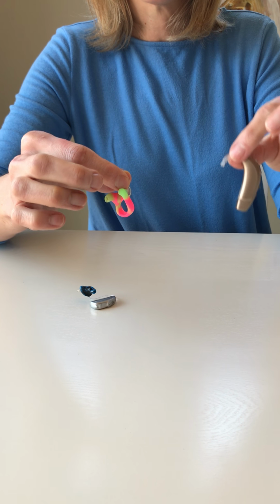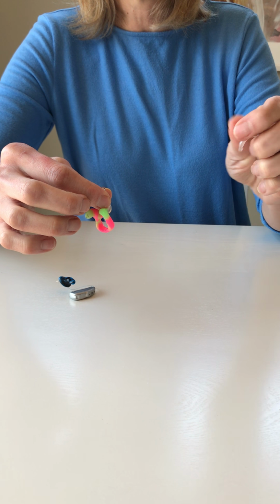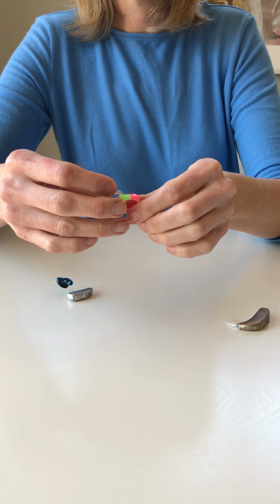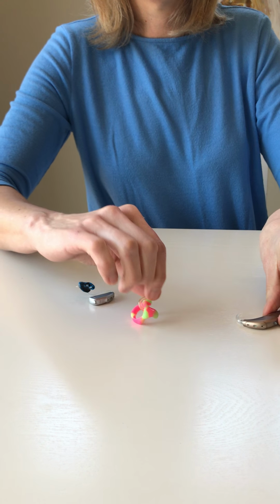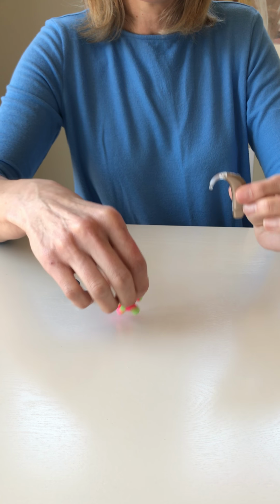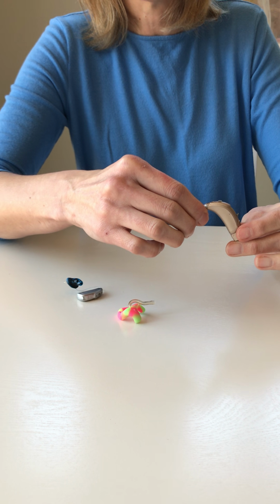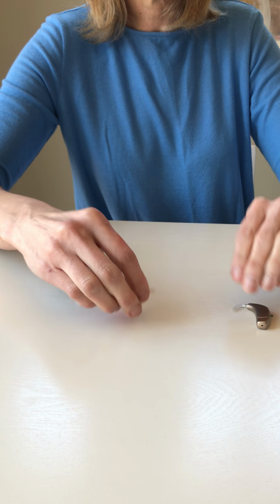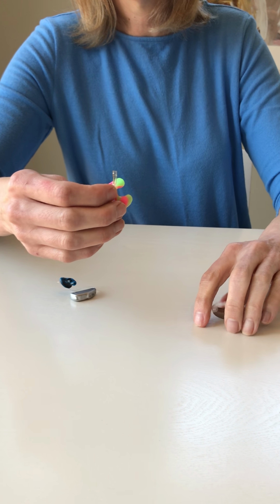Once I've separated those two, if I have a working battery, I should be able to cup this in my hand and hear it whistling and know that this piece is working, and therefore my problem must be this piece. If I had a working battery and this is still not working once I detach these two, then there's a problem with the hearing aid itself and I need to contact my clinical audiologist because this probably needs to go in for repair.